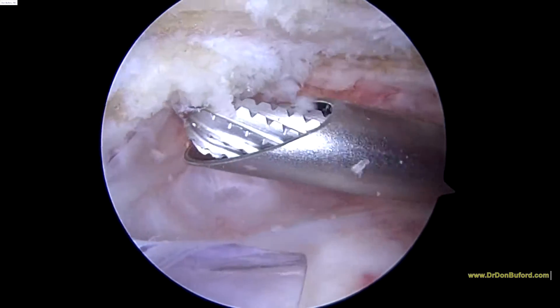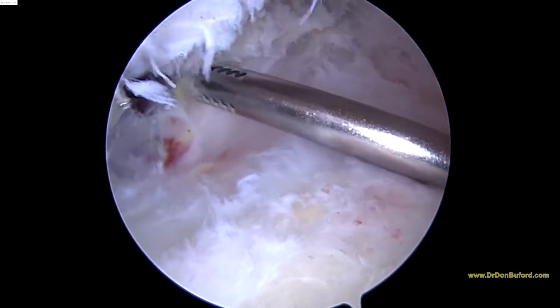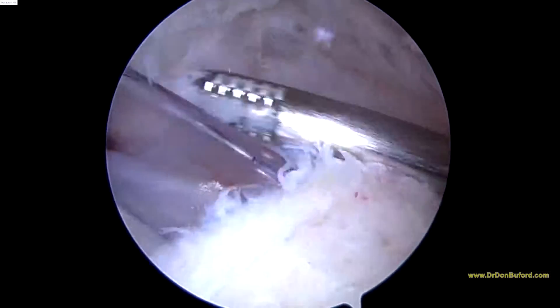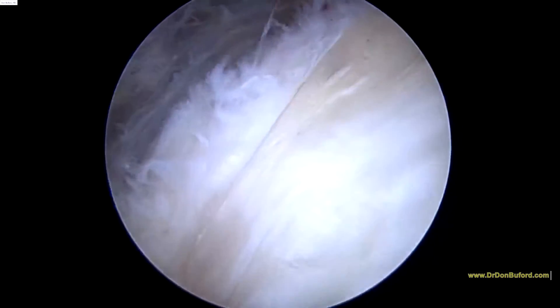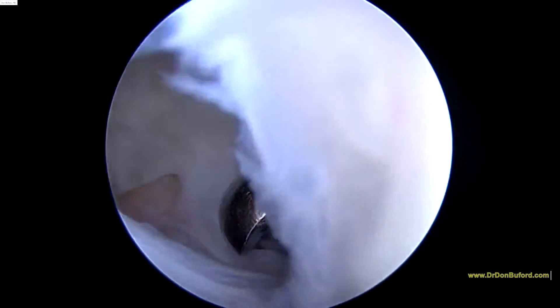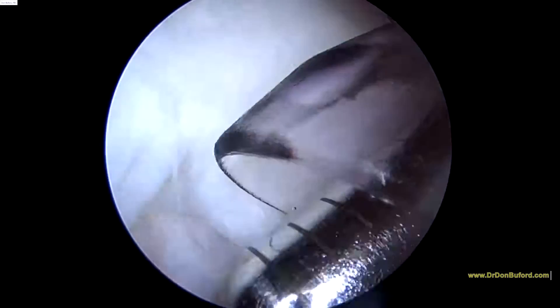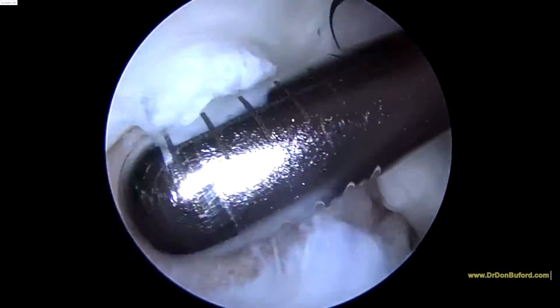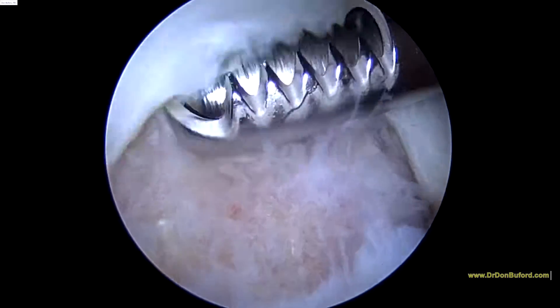We're going to go ahead and put our shaver in and have a good look at the rotator cuff on this side. This is why we look on the bursal side — even though it looks good on the articular side, when we get to the bursal side, look what we see here. This is where we've lost some integrity in the cuff. This is what's hiding that tear that we saw on the ultrasound. So if I undo that little part, you'll see how big this tear really is.